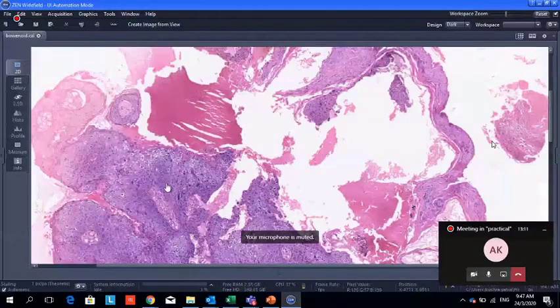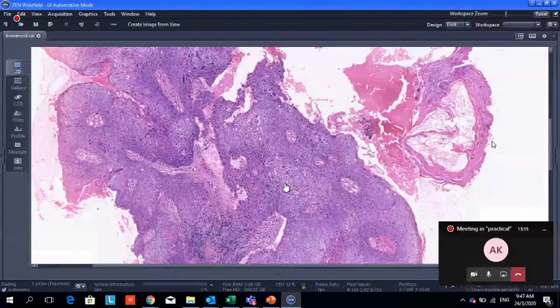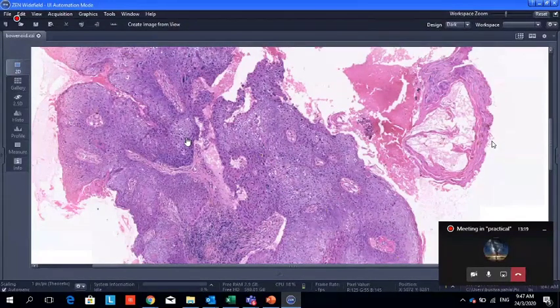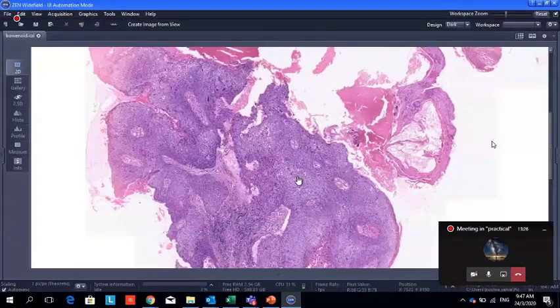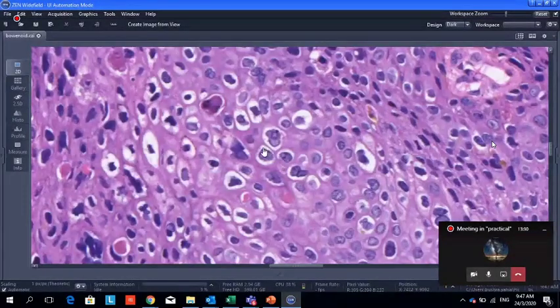Okay. Any question here? Doctor, is it cellulocytic? You said it's cellulocytic or koilocytic? Koilocytic cells, not cytocytic. Koilo. Yeah. See, look at the perinuclear halo.